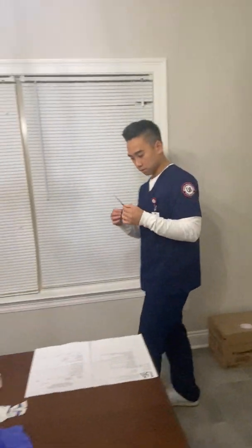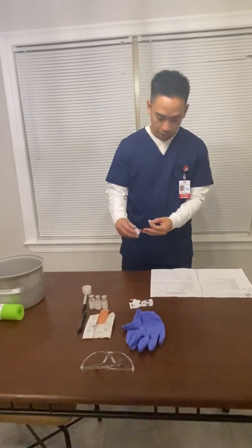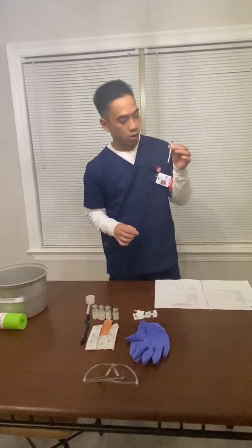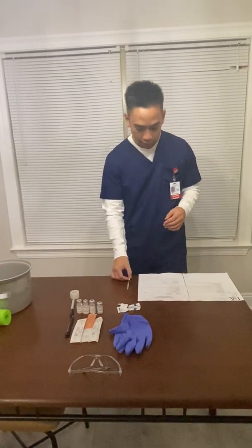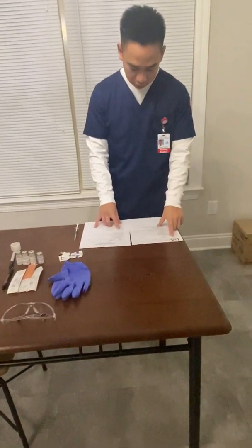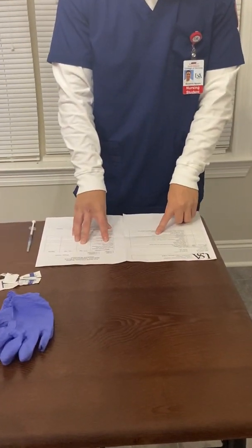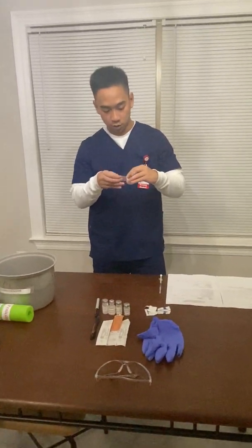All right, so after I do that, I'm going to come back to my MAR. So I had heparin 10,000 units per milliliter. My order was 5,000 units. So I drew out half a milliliter into my syringe. So after I do that, I'm going to go verify my medication order with another nurse as well as my calculations. I'm going to come back. I'm going to do my second verification of 5 rights. So Jaguar J. Jones, Heparin, 5,000 units, subcutaneously, every 12 hours.